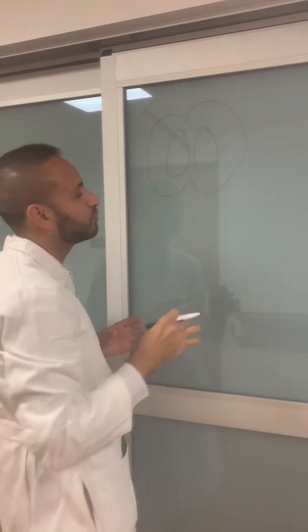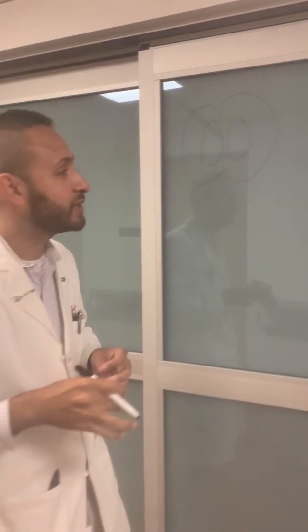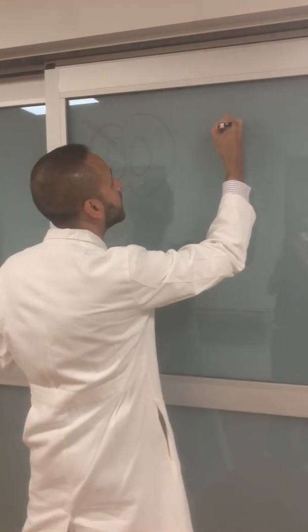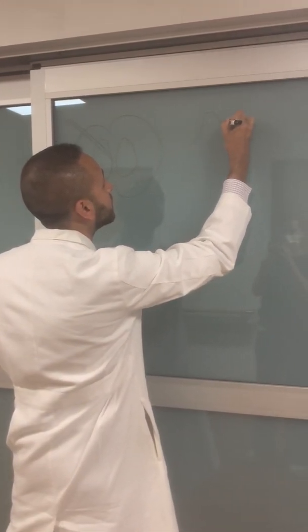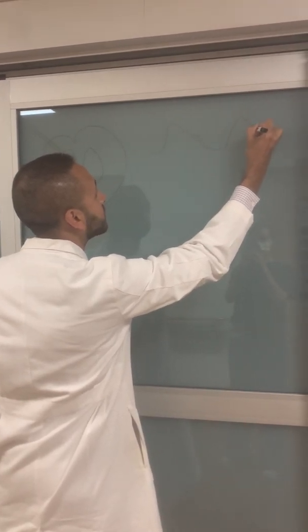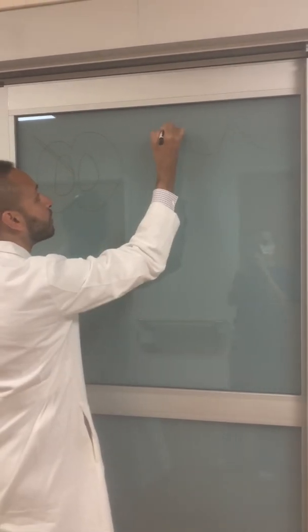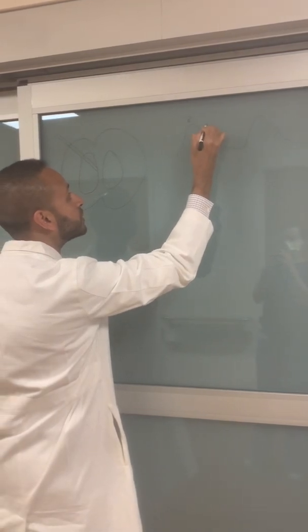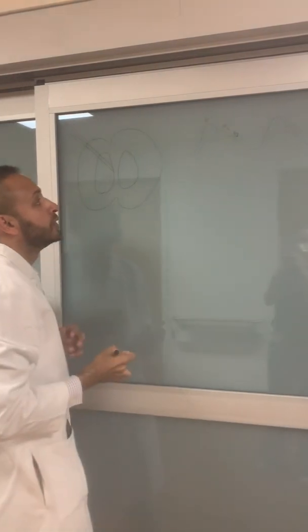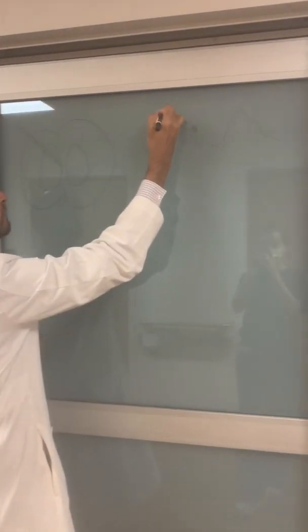I'm gonna show you a crude way of how we think about ICP waveforms, how they work. When you remember an ICP waveform, you see three peaks, and then it repeats again. This is your P1, P2, P3. So how does your P1 form?